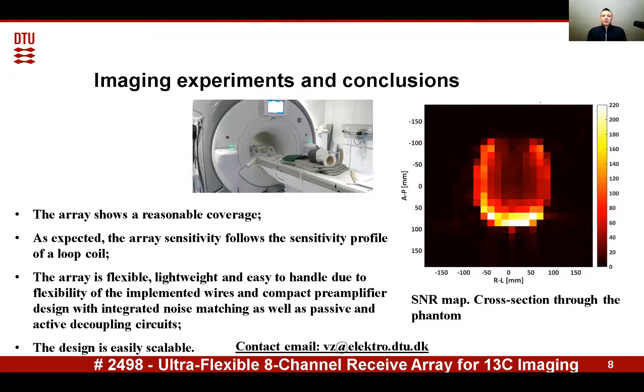To test the pre-imaging properties of the array, it was applied to a human head phantom. The photograph of the imaging setup in the scanner is shown here. The imaging experiment shows reasonable coverage. It should be noted that the array length is 50 centimeters.